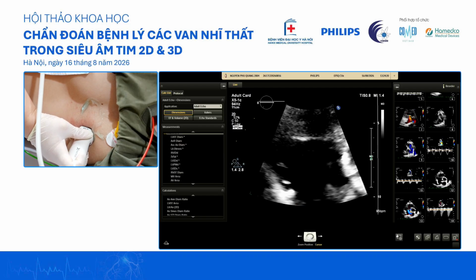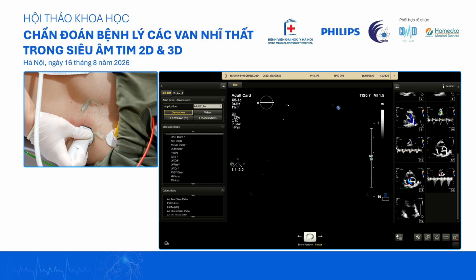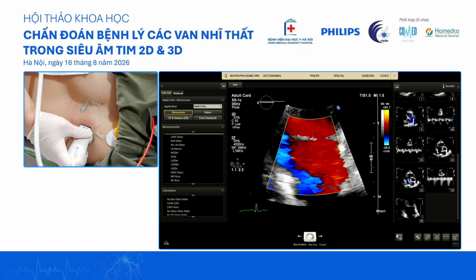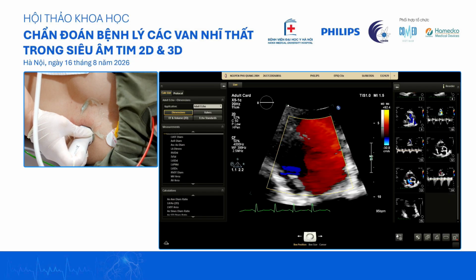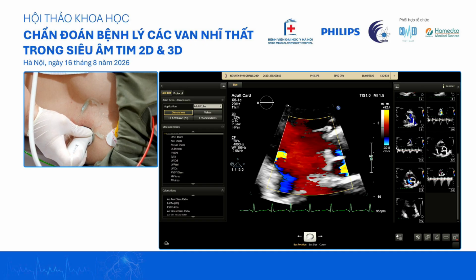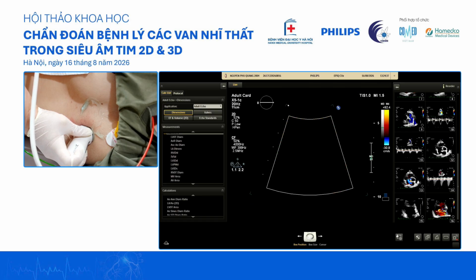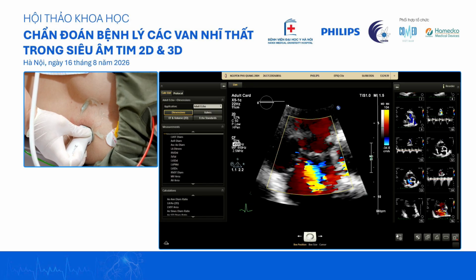Có thể thấy vận tốc hở van ba lá thì có vẻ cao hơn ở mặt cắt này so với mặt cắt đường vào thất phải chúng ta vừa làm. So a little bit of angulation is needed in order to see the PISA head. Chúng ta cần điều chỉnh một chút để có thể thấy được cái cầu hội tụ.